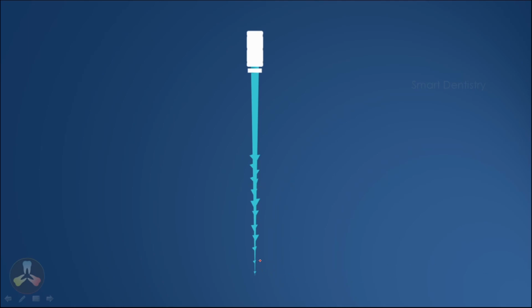And one more problem is, the small barbs which are present in the barb broach may get broken off and it may get entrapped inside. So barb broaches to remove the vital pulp in toto can be used only in case of teeth which are having wide root canals. Tip number 25.